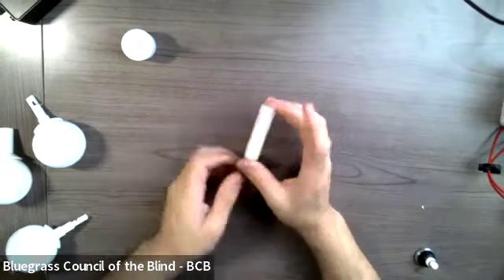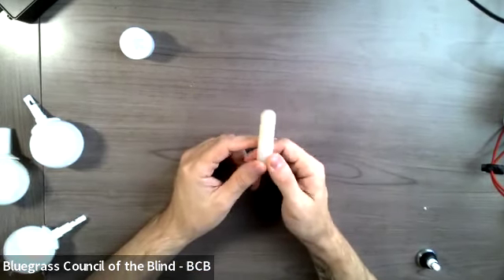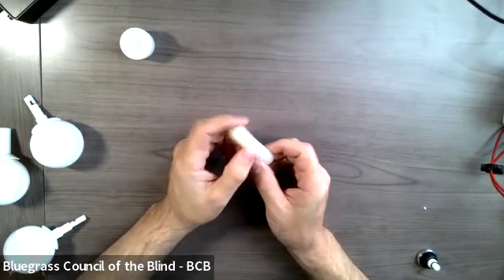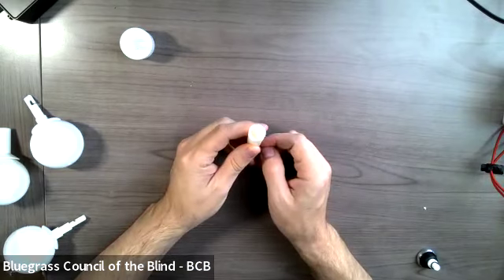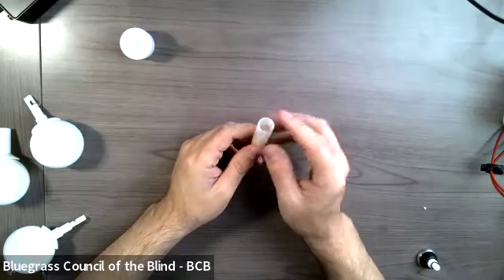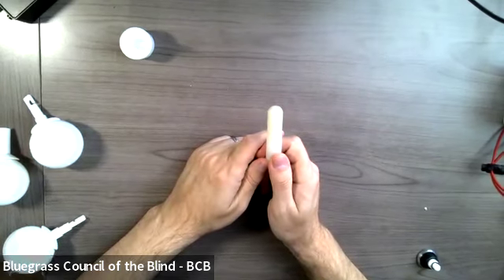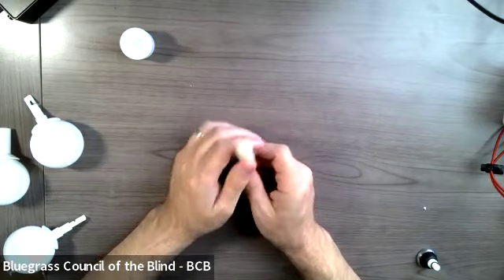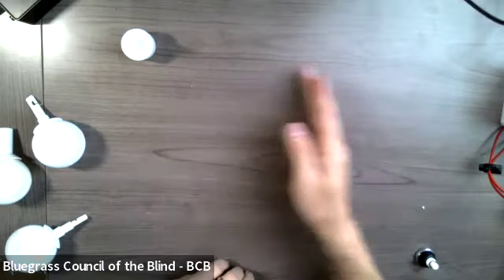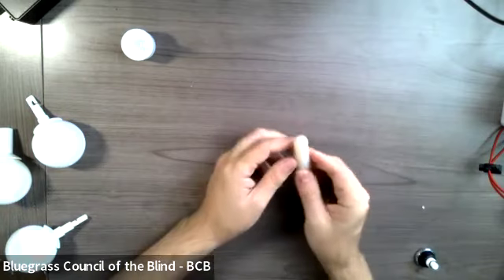Another very popular tip is just the simple pencil tip, named that because it's shaped very similar to a pencil. It has a very blunt end here, very skinny. This particular one is a slip-on, but they do have hook style as well, and even the screw style. Now, the thing with a pencil tip is it's not the best for constant contact users. A constant contact user is somebody that sweeps their cane side to side and keeps it constantly in contact with the ground. So they slide back and forth.